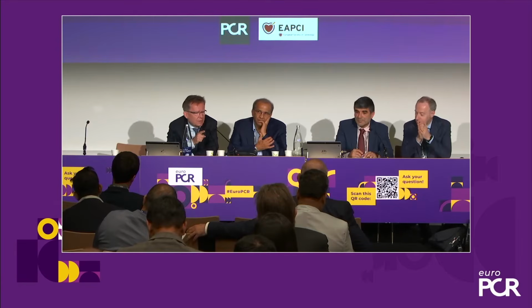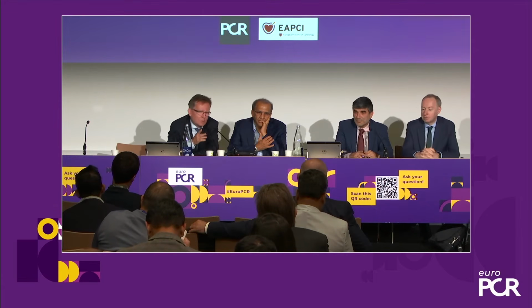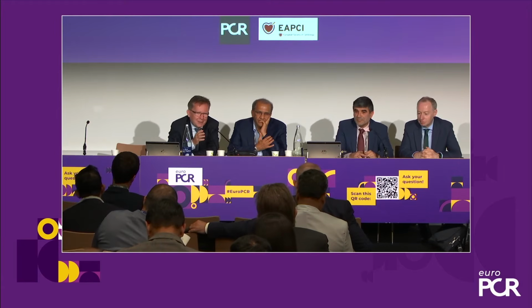What about you, Piotr? Yes, I agree. I think that CTO procedures are quite long by definition, and I would conclude this case as quickly as possible. Of course, I'll start with a small balloon, but it was not crossable. If it's not crossable, I'm going with laser. What are the advantages? Because it was very tricky and very difficult to cross the Gaia wire. It's impossible to cross with, for example, a rota wire. You agree with me, I suppose. But in this situation, laser is the best option.